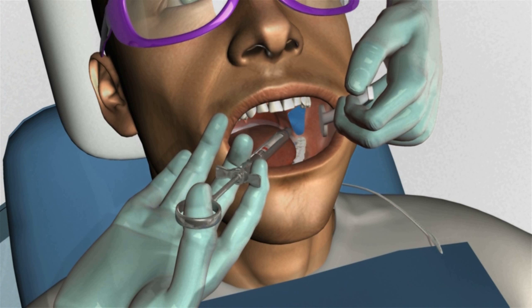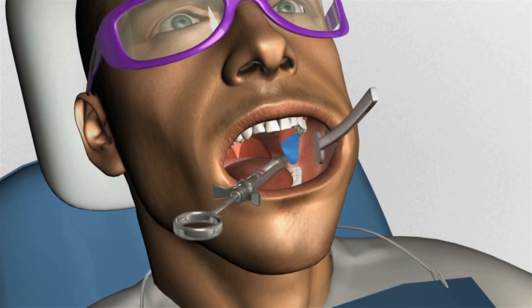Visualize the anatomy and injection triangle. Approach the penetration site while keeping the body of the syringe over the contralateral premolars. Hold your syringe with your palm facing the ceiling. At 6 to 10 millimeters above the occlusal plane, slowly advance the needle into the tissue until you make gentle contact with the bone on the medial aspect of the ramus, and at least half of the needle length is in tissue.